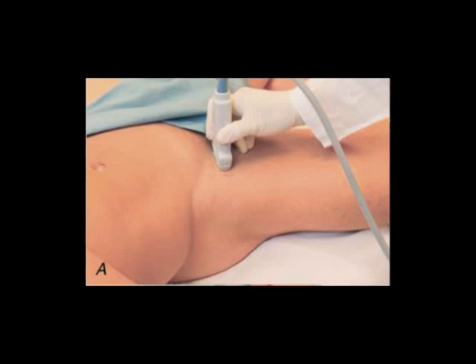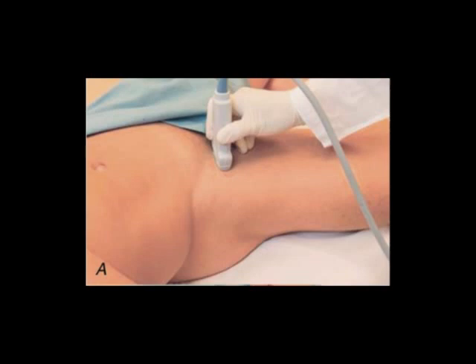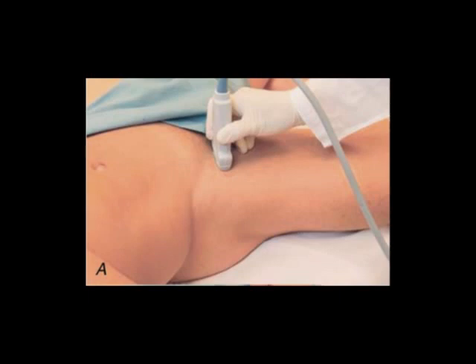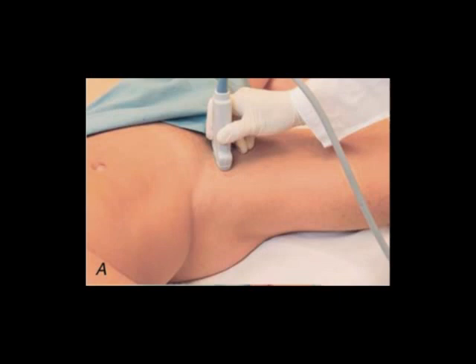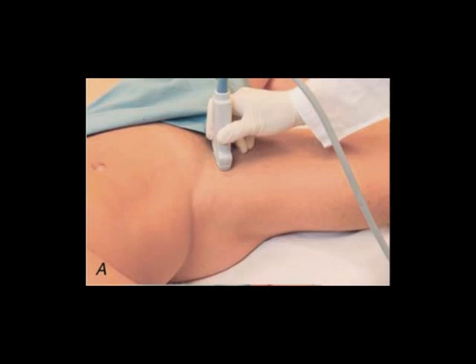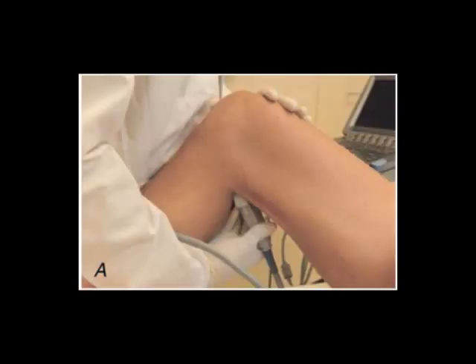This picture demonstrates just how high up you need to start for some of the more proximal points of interrogation for a DVT exam. It also shows excellent patient positioning with gentle flexion of the hip, slight external rotation of the leg, and draping for modesty — ultimately setting up the sonographer for the acquisition of good quality images and a successful lower extremity DVT scan.